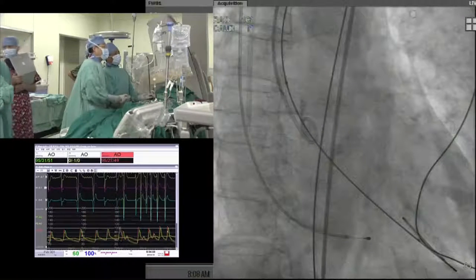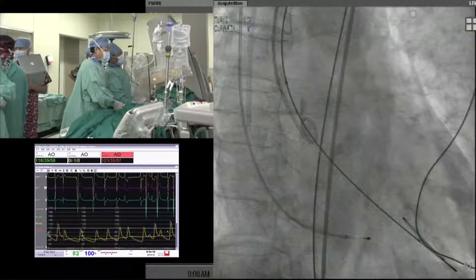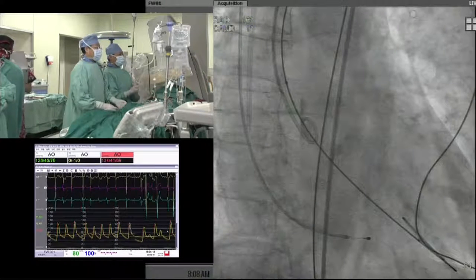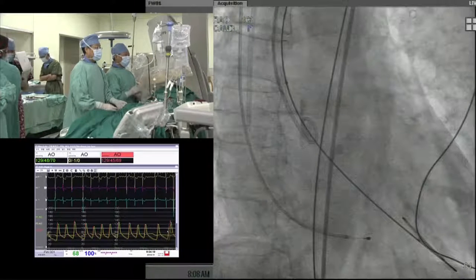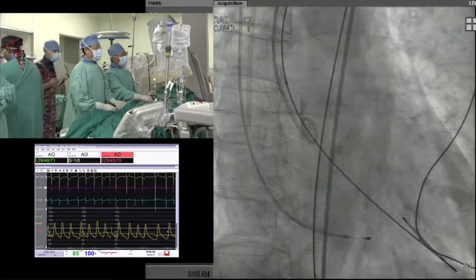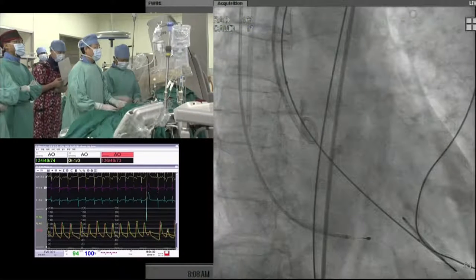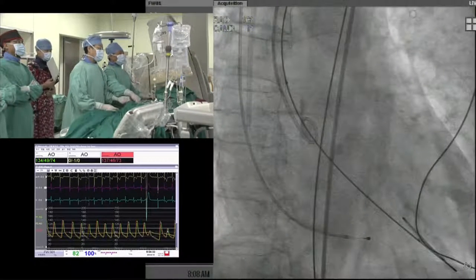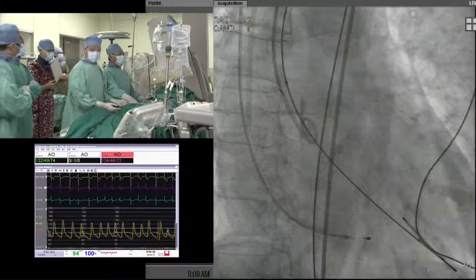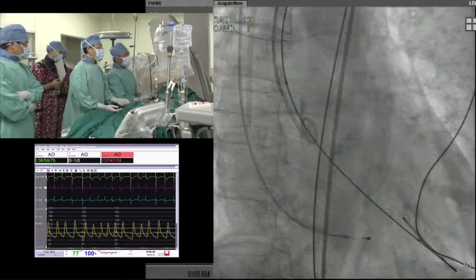We should try again. She's tolerating the pacing well. The blood pressure is still good. But I think it's very calcified, so it should be blown totally. I'm afraid the predilation is not enough, so maybe the positioning for the prosthesis will be difficult. The last balloon dilatation seems to be complete, but we should do the final balloon dilatation again just to confirm that. Panelists, can you give us some suggestions?